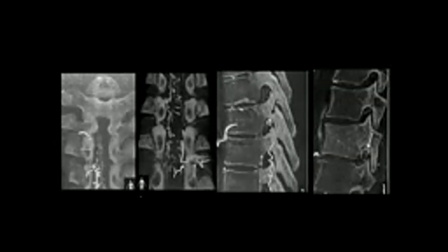And you can see the fistula point easily, like a surgeon. And it is in your hand. You can manipulate with your mouse and then cut the raw data according to your wish, your vision.